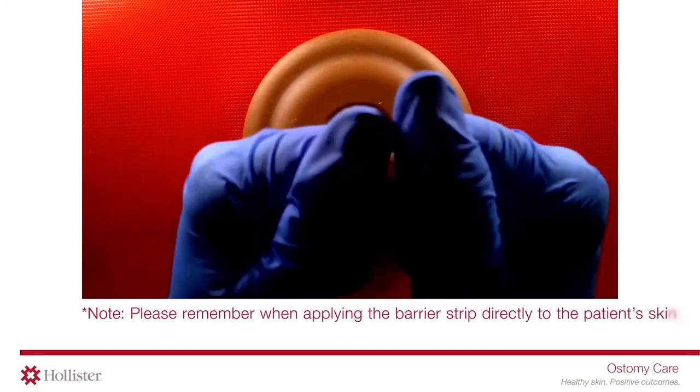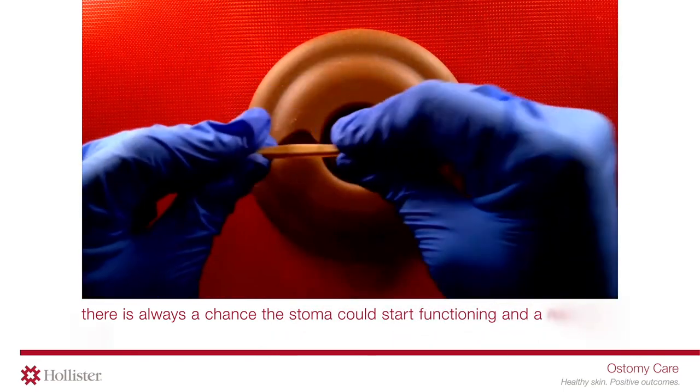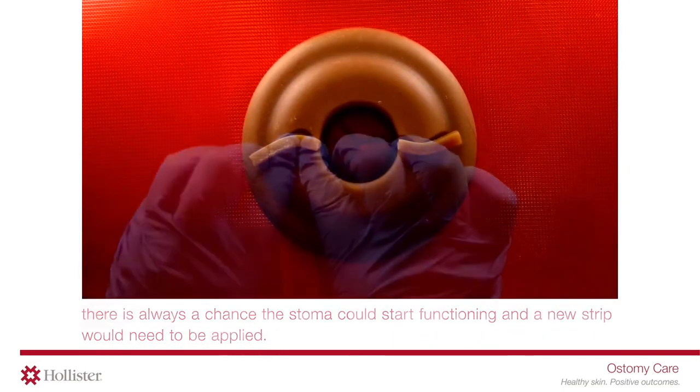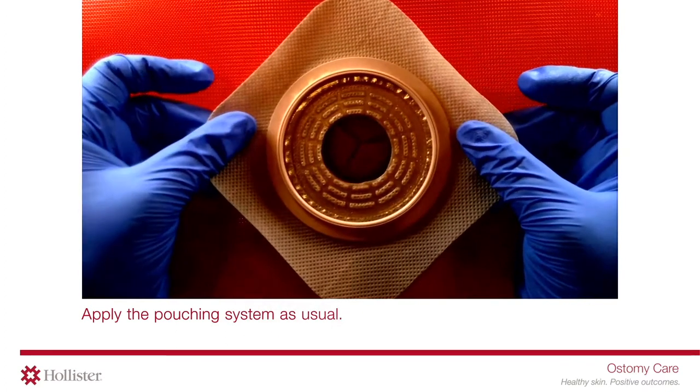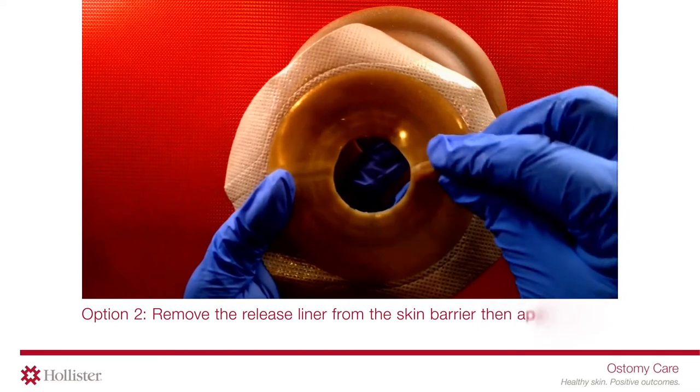Option one: apply the barrier strips directly to the patient's skin. Please remember, when applying the barrier strip directly to the patient's skin, there is always a chance the stoma could start functioning and a new strip would need to be applied. Apply the pouching system as usual.